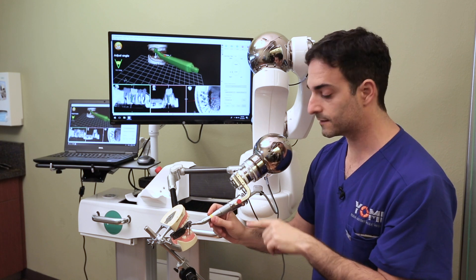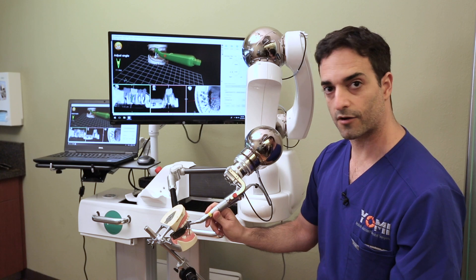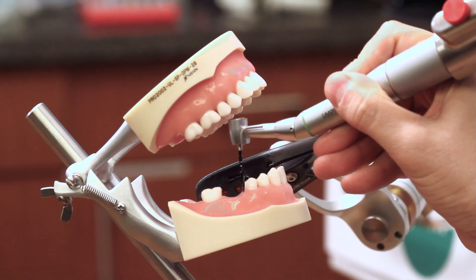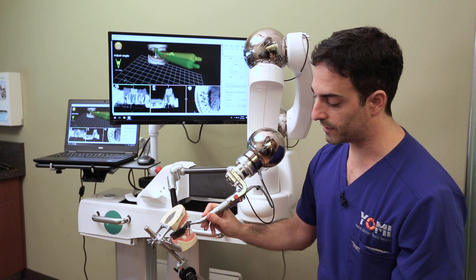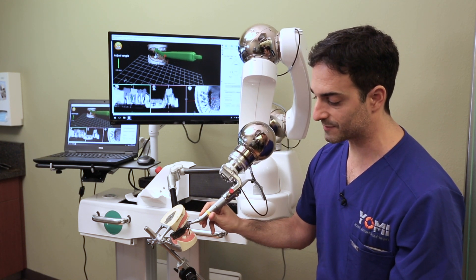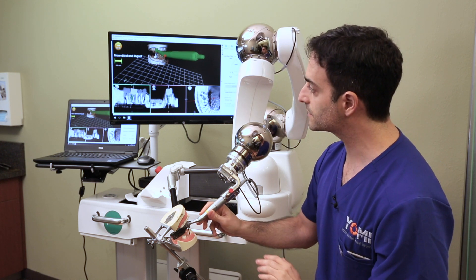Most importantly, it physically guides me. By applying just a little bit of force, it brings me to the correct angle. If I try and push the wrong way, it feels very stiff and heavy. I'll take it all the way in the correct direction until it stops me again and says, okay, now you have the right angle, but you need to translate to get to the starting position.